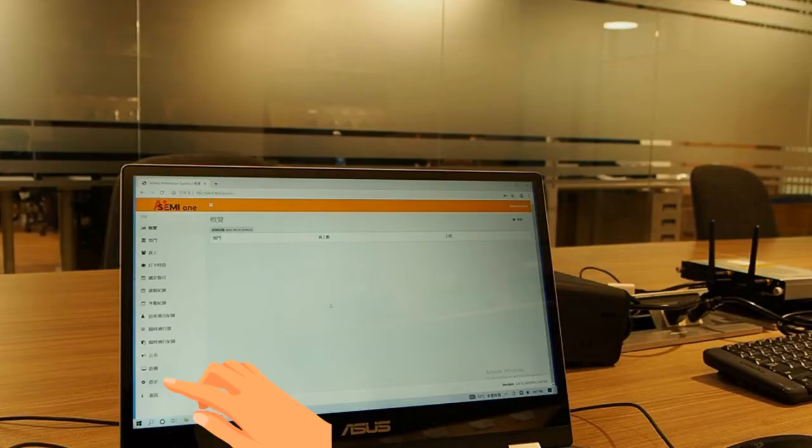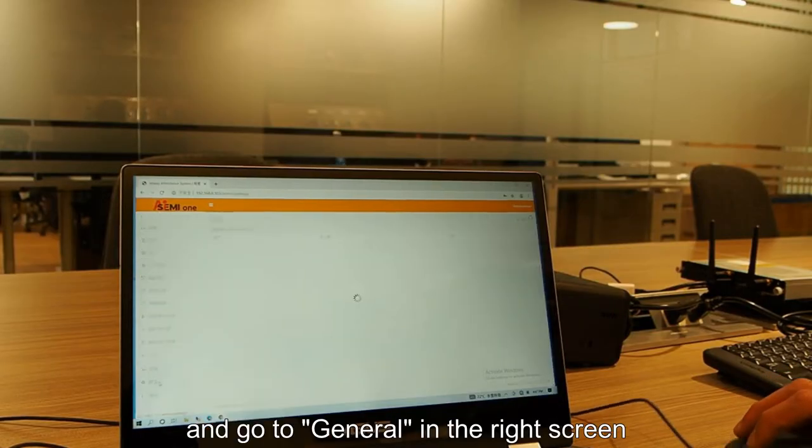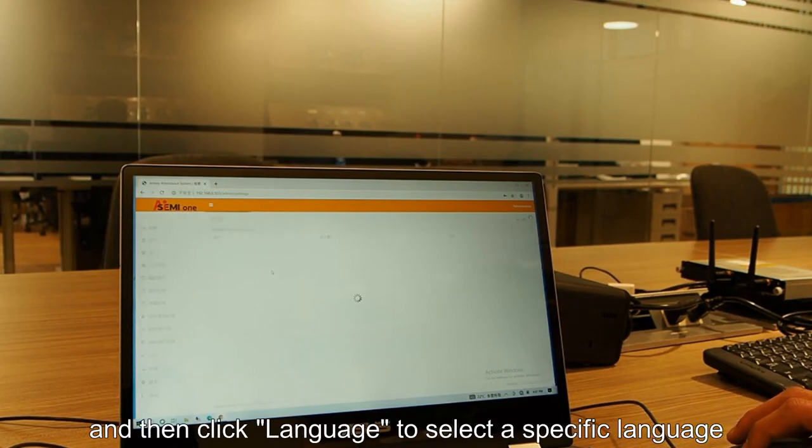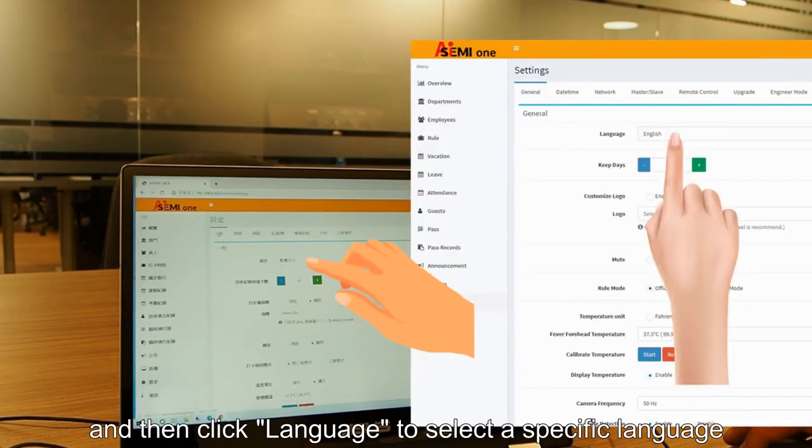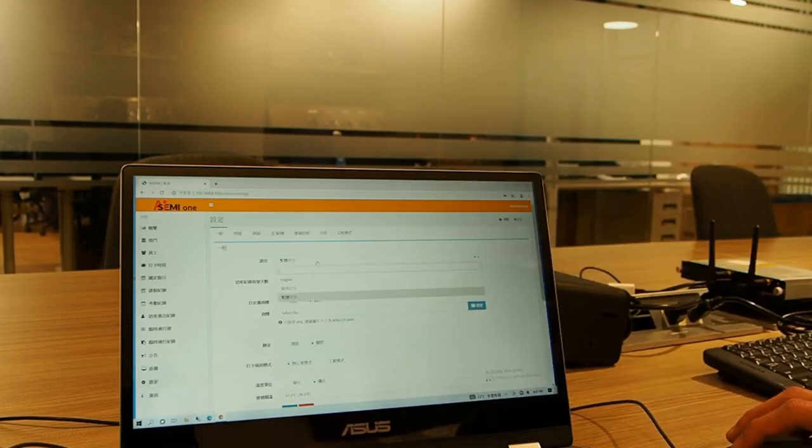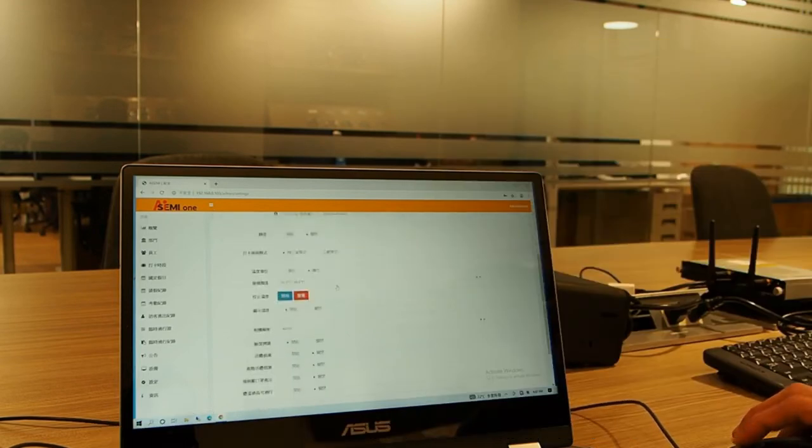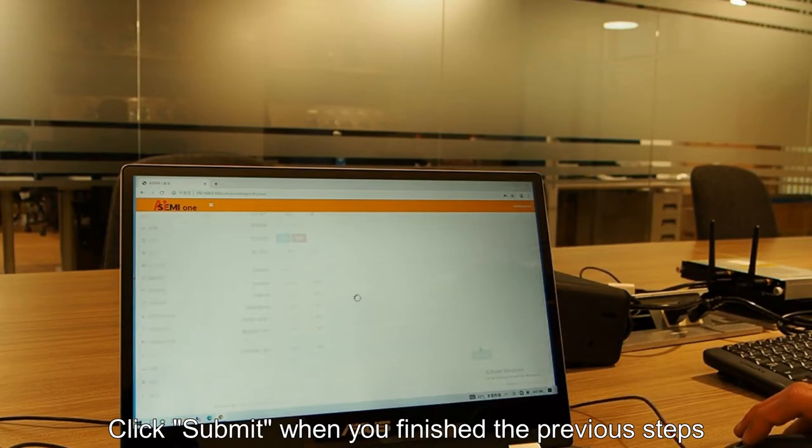Please click the settings in the left column and go to general in the right screen. Then click language to select a specific language from the drop down menu. Click submit when you finish the previous steps.